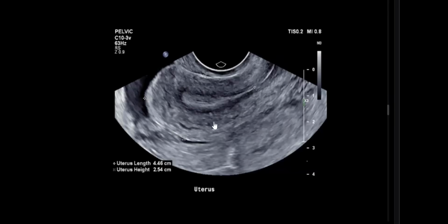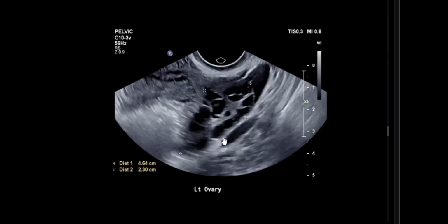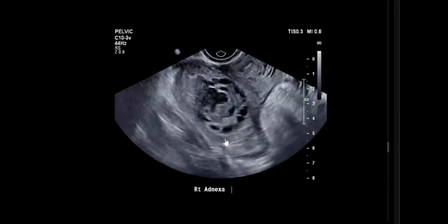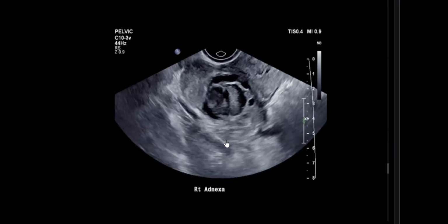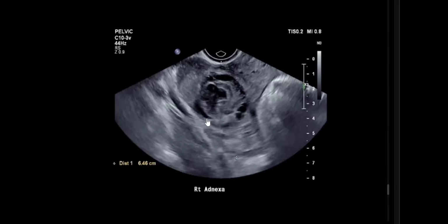We did a complementary vaginal ultrasound. Uterus is normal, empty, doesn't contain any decidualization or sac or whatever. And we have heterogeneity around. On the left adnexa, normal ovary or some PCO appearance. And on the right side, it's a hematoma, a heterogeneous structure surrounding the ovary, which represents a ruptured ovarian cyst or disturbed ectopic, according to beta subunit. So this is most likely a ruptured ovarian cyst.